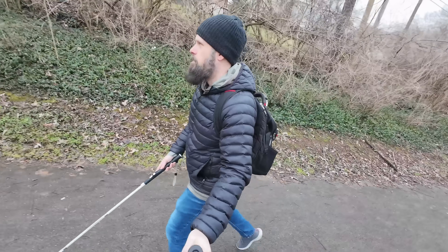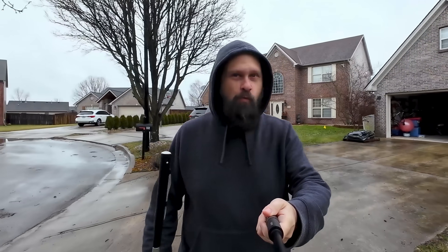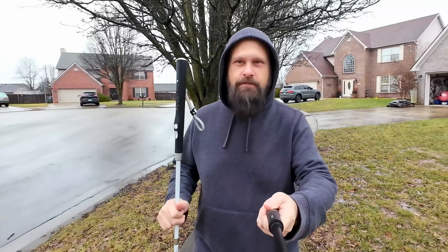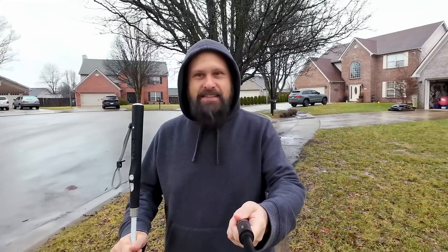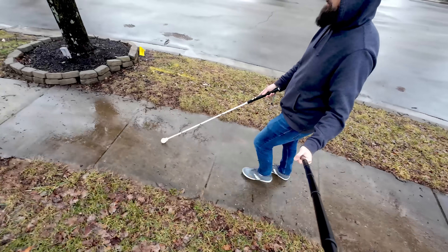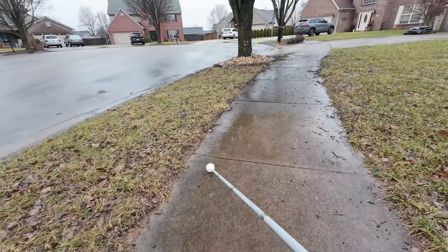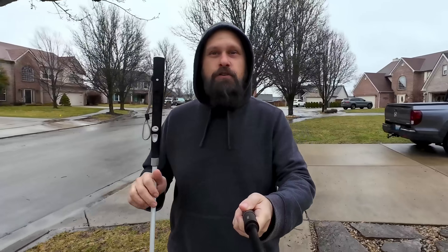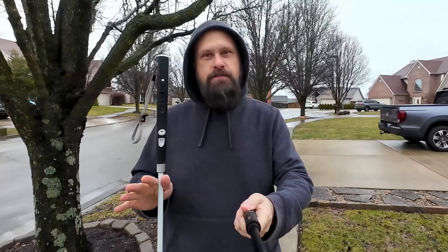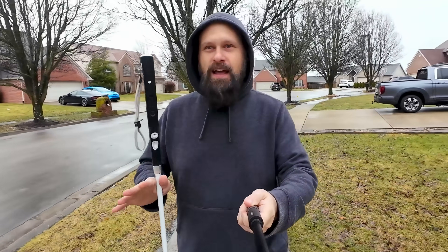It's a rainy, wet, cold, miserable day out today, but I'm out here to talk about another new feature of the WeWalk Smart Cane Version 2 — and that is that it is now rain resistant. So while you shouldn't go swimming with it, if you do have to go out on a cold rainy day, you can do it with confidence knowing that your Version 2 Smart Cane is going to perform in those conditions reliably.